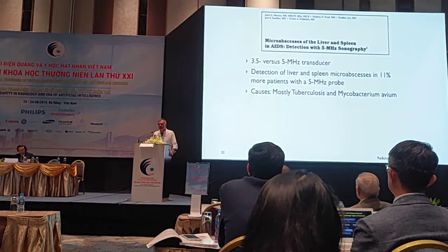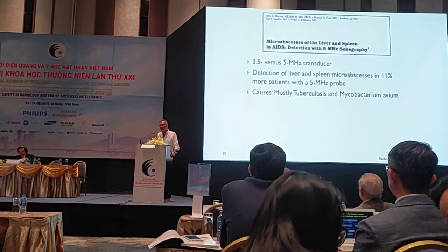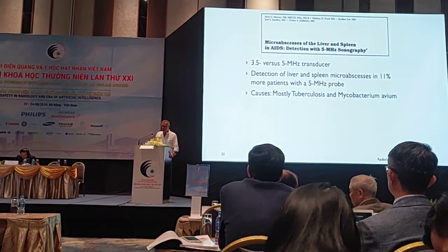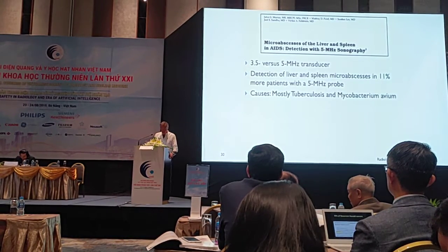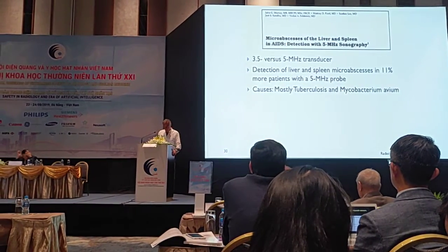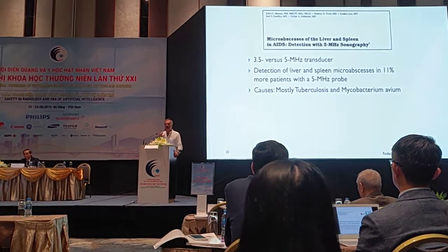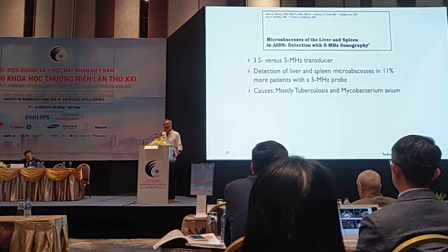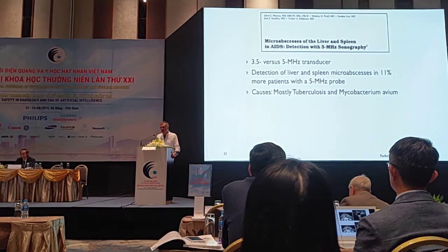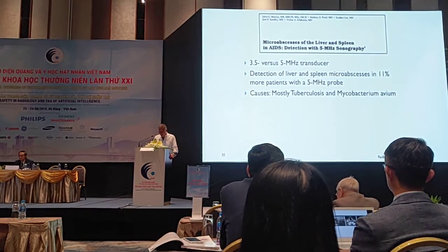And if you want to use ultrasound, I strongly recommend you use ultrasound because CT is not always the only solution. I like ultrasound very much. It is highly recommended to use a high frequency transducer. In this paper, which is quite old, they compared 3.5 to 5 MHz transducers. Now I would suggest going directly to 7.5 or even 10 MHz, because we have a much better detection rate and characterization rate than with CT.